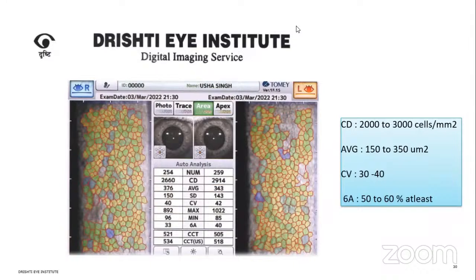I have one question, Dr. Tulsi. In uveitis, in confocal microscopy, for example for CMV anterior uveitis, we can see those typical owl's eye cells. But here, is there anything in particular that we can use?